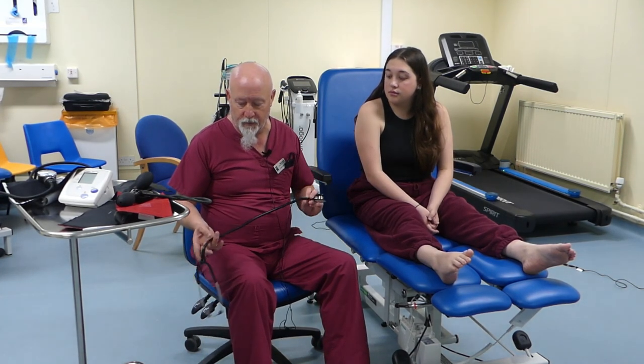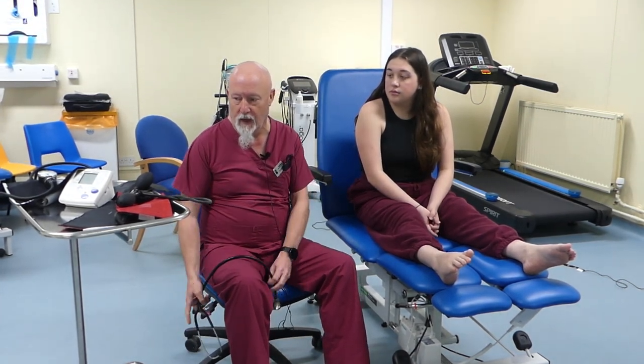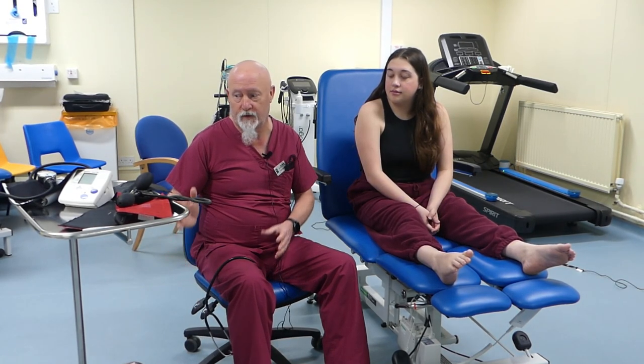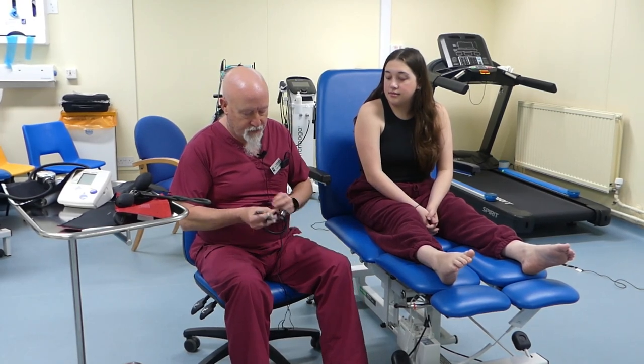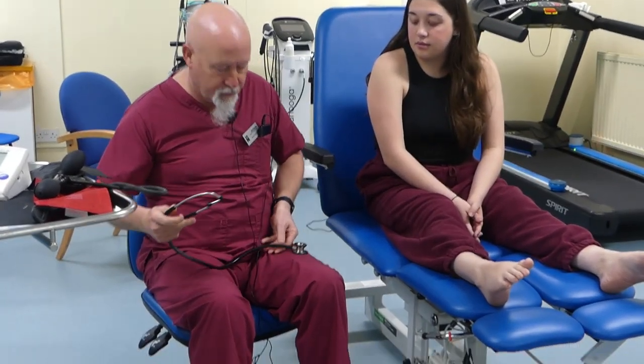The equipment you need is going to be a stethoscope and a sphygmomanometer, of which there are a couple of different types. This is a stethoscope that you'd be expected to be able to use.